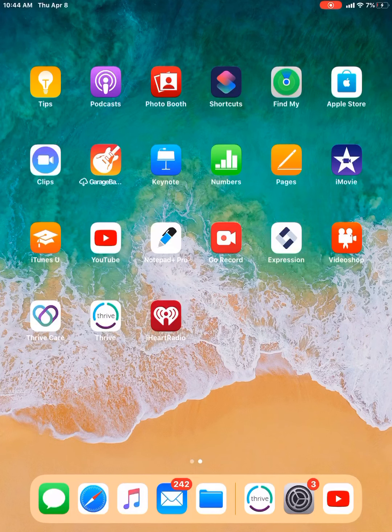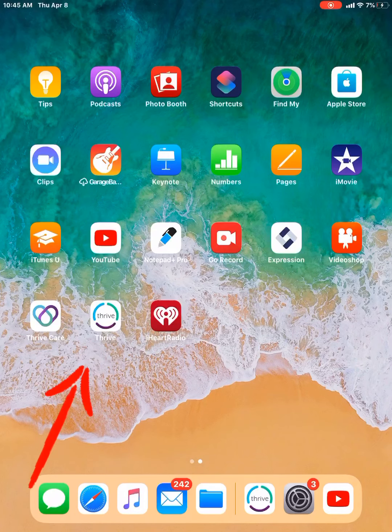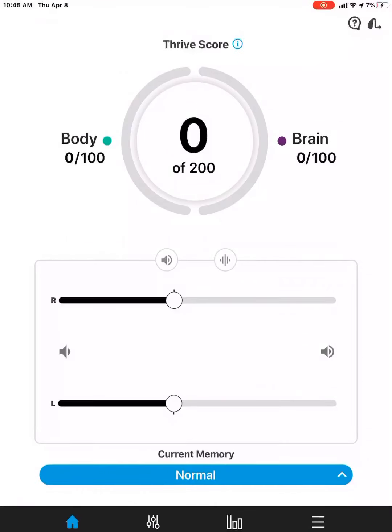For the purpose of this video, I'm just going to get right into it. We're going to open up our Thrive app. I have a set of Livio Edge AI receiver in the canal style hearing aids paired to an Apple iPad for the purpose of this video. So we're going to tap the Thrive app to open it up.